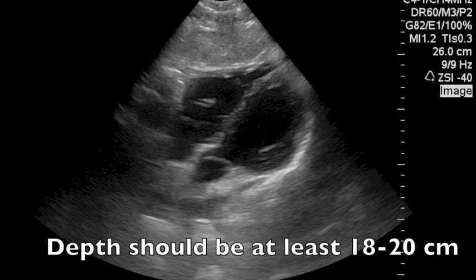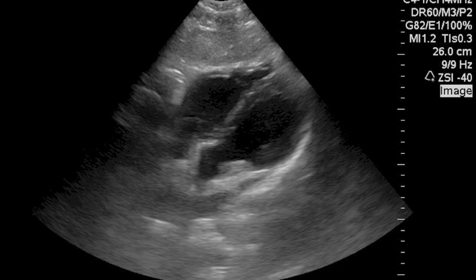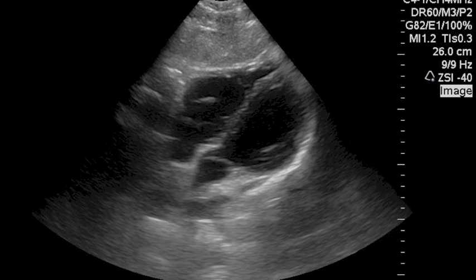Normally, if you're doing the FAST exam, for example, you want to make sure there's no fluid on the heart. You're also evaluating cardiac motion.